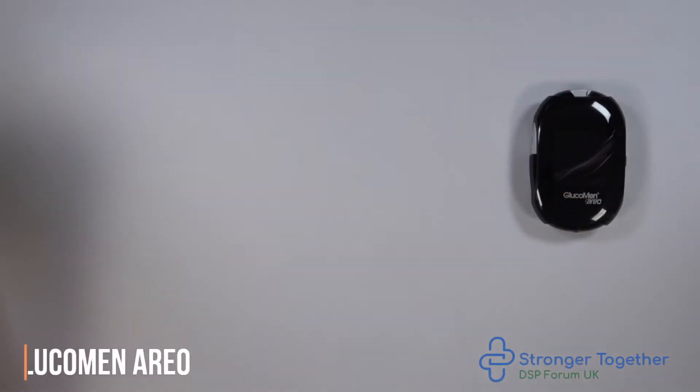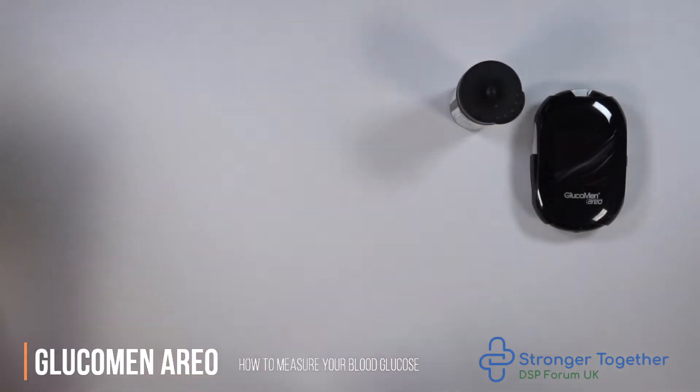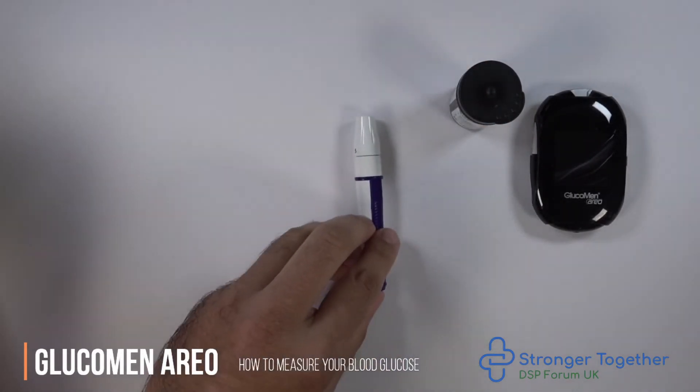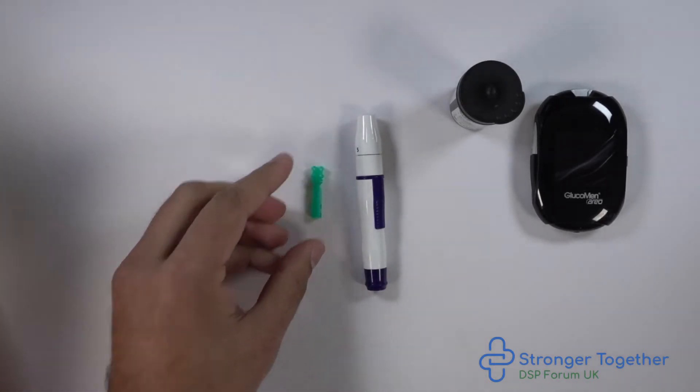You have been directed to this video because you have a glucomine REO blood glucose monitoring meter. We will demonstrate how to measure your blood glucose here. Remember to wash your hands with soap and water and then dry thoroughly before testing, as unclean hands can affect your test results.